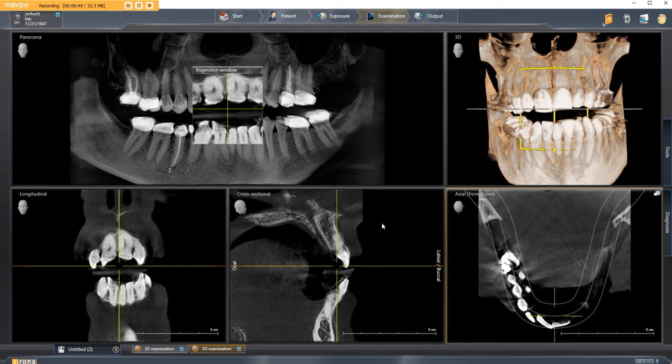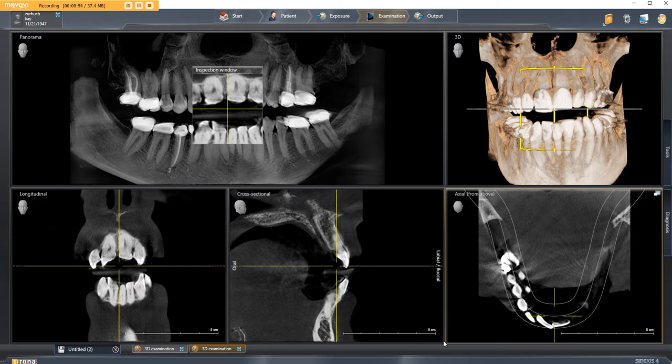The only time you need high res is when you're performing an endo scan. For cone beam, leave it off, and then your file size won't be too large.